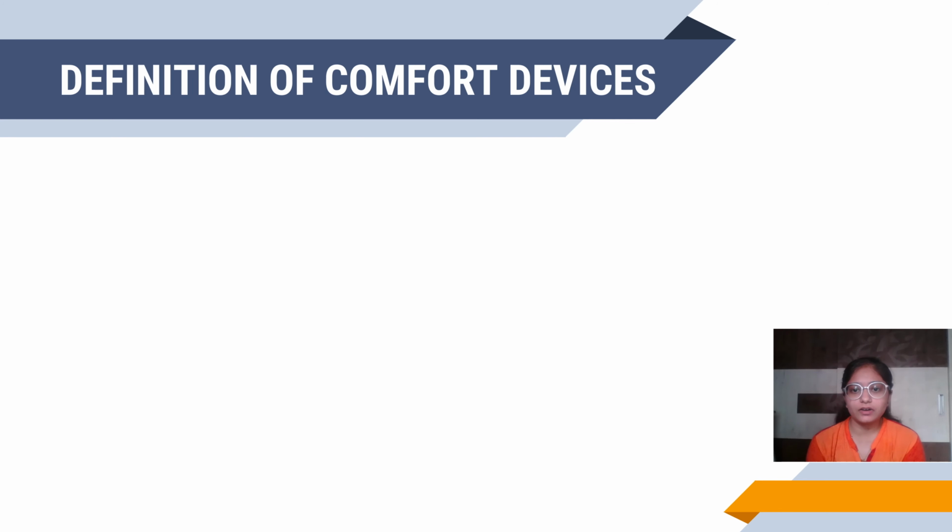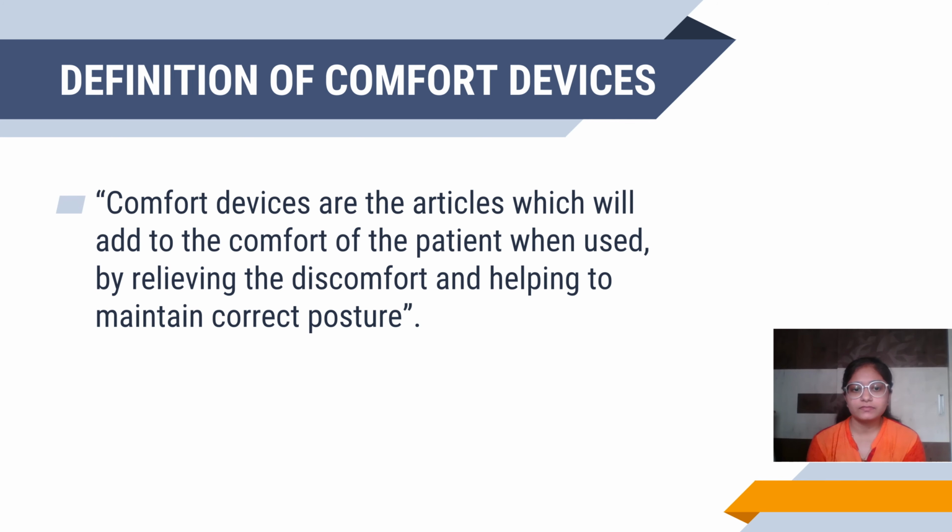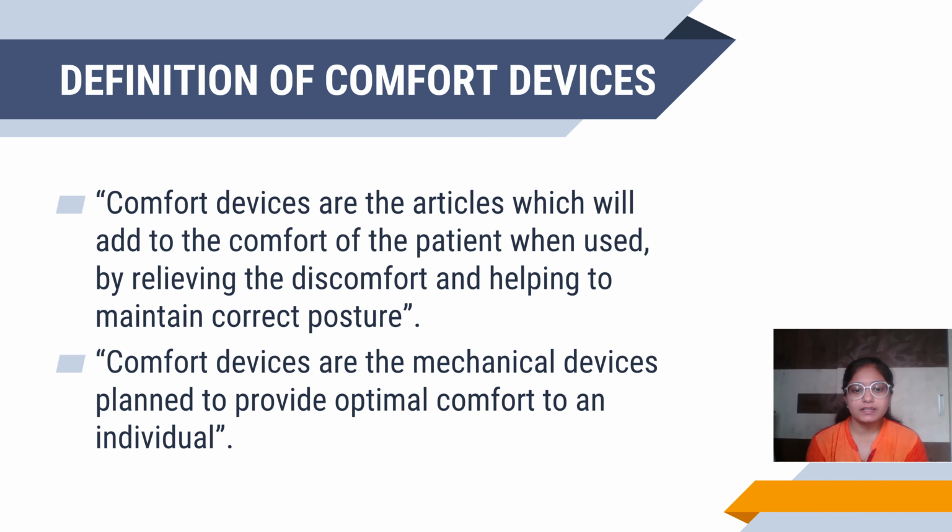Next, what are comfort devices? Comfort devices are articles which help to provide comfort to the patient by relieving discomfort and maintaining correct posture. Second, comfort devices are mechanical devices which help to provide optimal comfort, that is, the greatest comfort, to an individual.